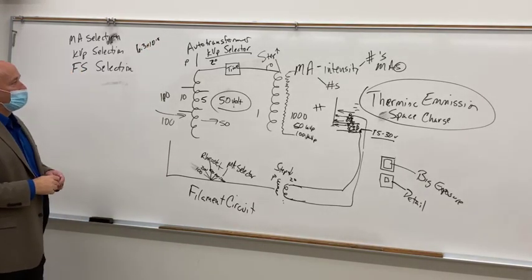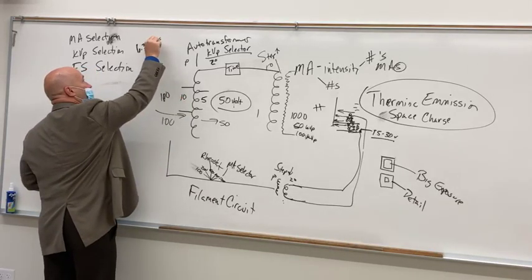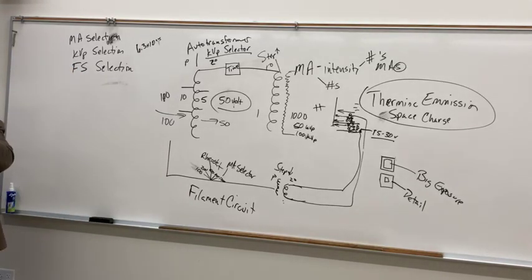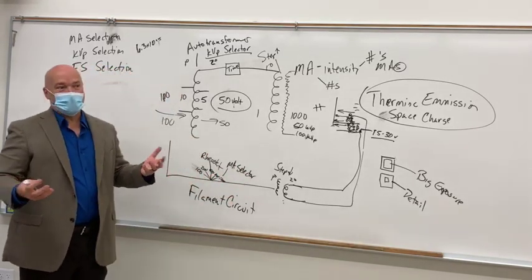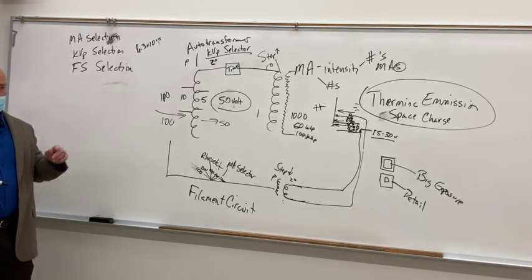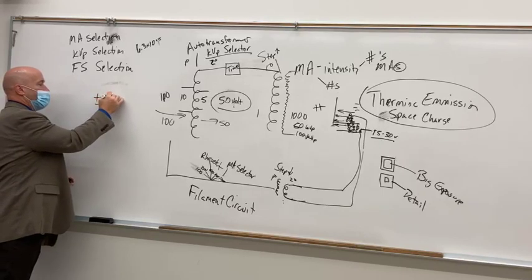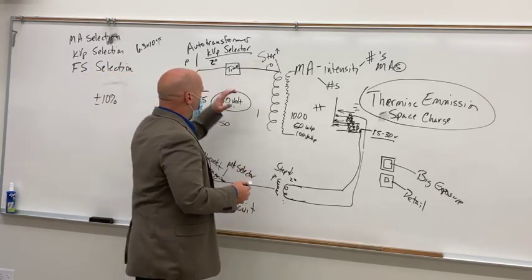So it's a ridiculous number of electrons, and even if we're dealing with mA, and even at a low mAs value, that's still a lot of electrons, right? So when I say a rough estimate, it's a rough estimate, but it's really pretty close to a good estimate. Our timers can actually be inaccurate to, I think, within plus or minus 10%, okay? So it's an estimate, but it's really a pretty close estimate. So our timer circuit's going to be there.